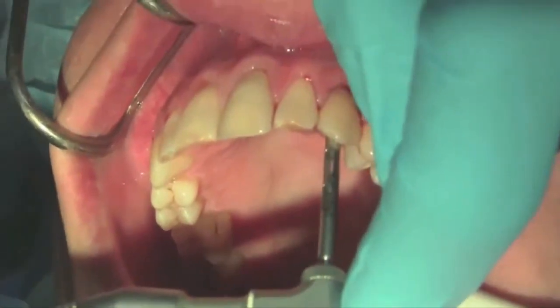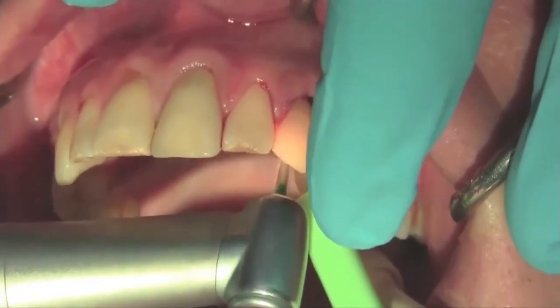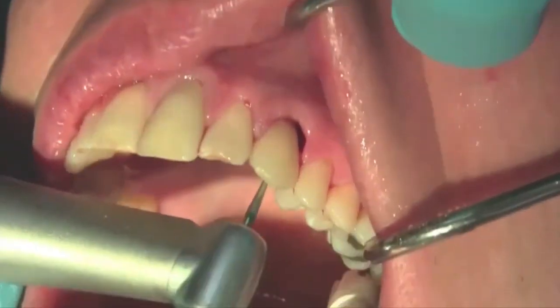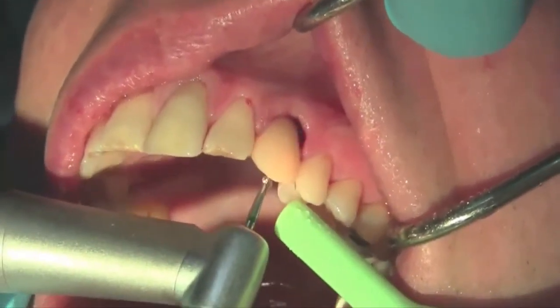We have to proceed to clean the excesses of acrylic, and in this case we had to utilize a burr. It's important to use suction because you don't want the particles going into the surgical site. Once you have access, you proceed to remove the crown, which is now attached to the abutment.